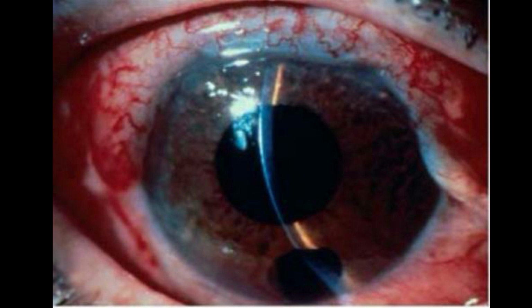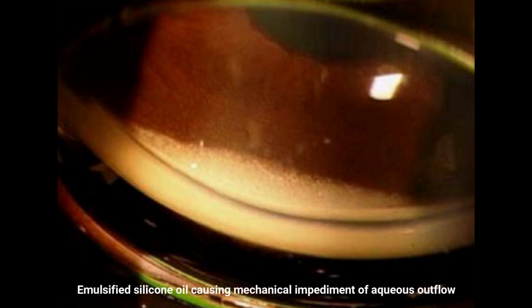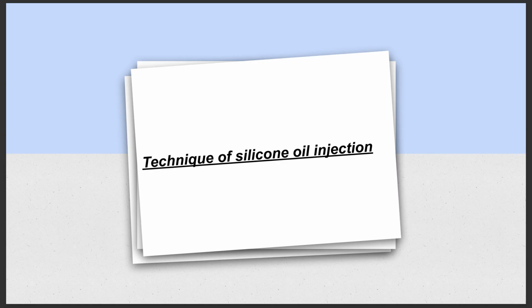Silicone oil causes secondary glaucoma with increased intraocular pressure. In this picture we can see emulsified silicone oil in the anterior chamber. In this picture we can see a gonio photograph of emulsified silicone oil blocking the angle, causing mechanical impediment of aqueous outflow, which in turn is increasing the intraocular pressure.